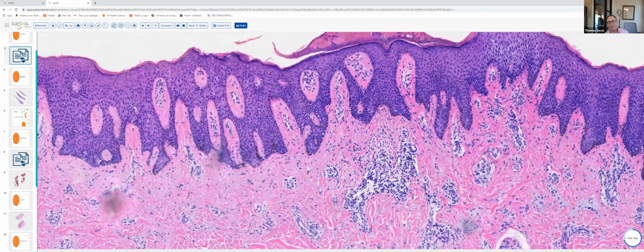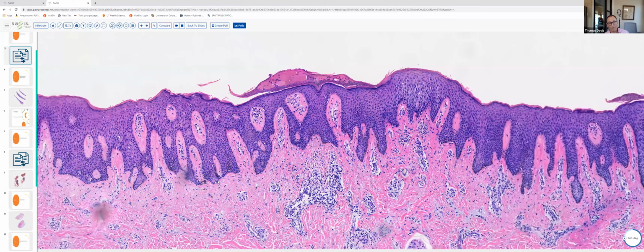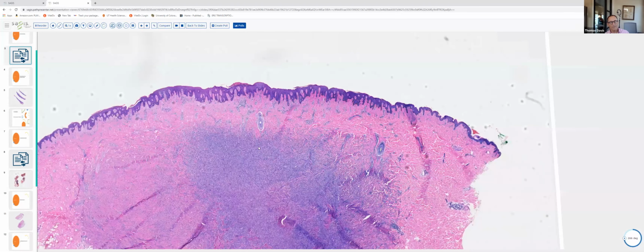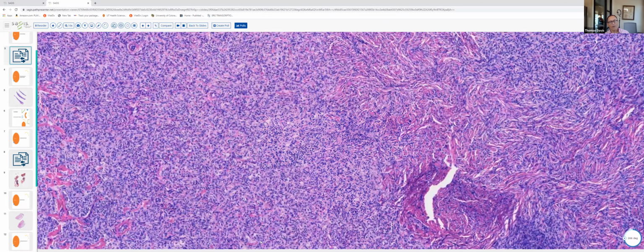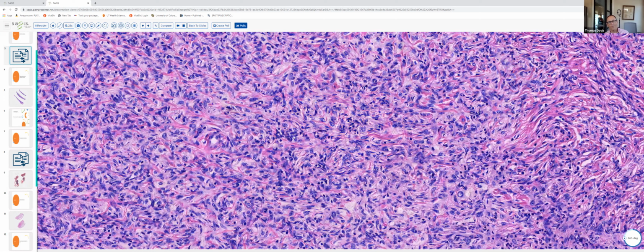There is an increased amount of melanin pigment within basilar keratinocytes, and many of the rete are fused. And of course, this pattern of epidermal hyperplasia with hyperpigmentation is frequently seen over dermatofibromas. The proliferation itself has hypocellular, lighter staining areas, and hypercellular areas. If we look at the constituent cells at higher power, we can see these short intersecting fascicles of fibrocytes and histiocytic appearing cells, so that the cells have oval, fusiform, and spindle-shaped nuclei.